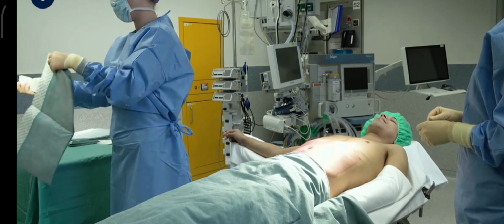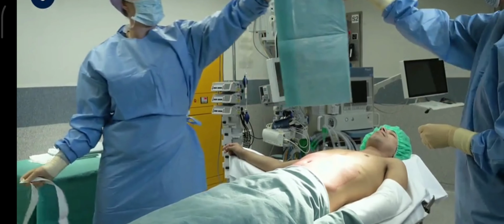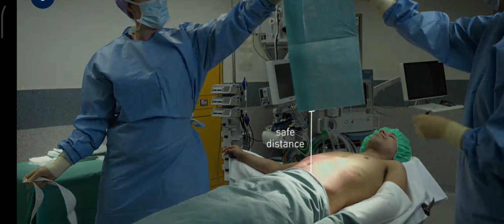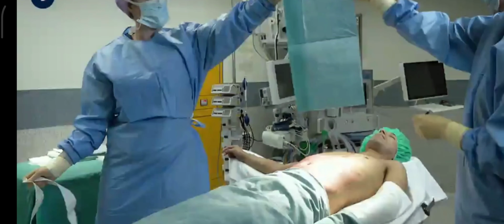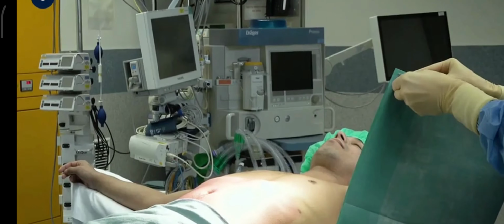A safe distance is maintained, the drape unfolded and the adhesive part uncovered. The drape is handed over above the table. Take note of the distance between the drape and the unsterile area below, and of how both OR team members try to minimize contact with the adhesive strip of the drape. The single drape is unfolded by the surgeon on their own, as shown.